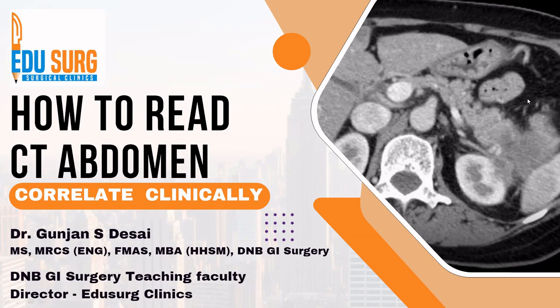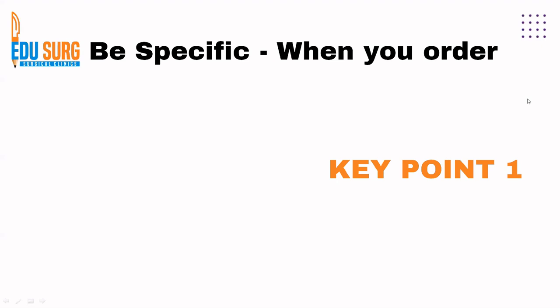As you know, we are already running a series on radiologic clinics. You can check the playlist on radiology. It is by the name Correlate Clinically. And what we are going to do here is discuss the CT abdomen and a structured approach to avoid missing out problems in CT abdomen.